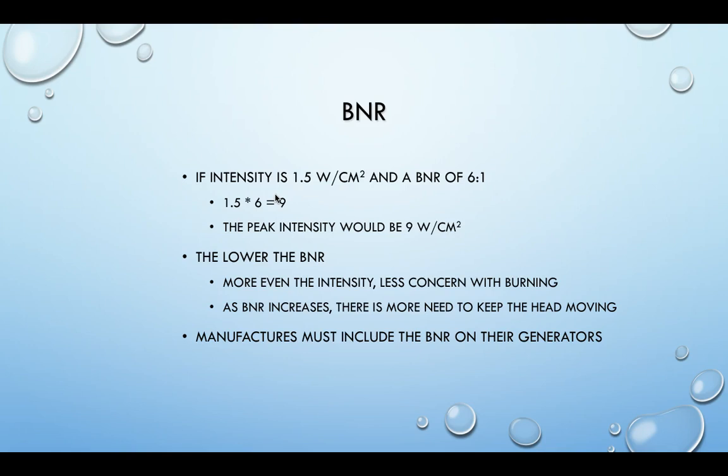And that can actually be dangerous, okay? That can create burns. It can create what we call hot spots, which are areas of this increased intensity that feel very hot and burning to the patient. So this is one of the reasons, we'll have about 3 reasons, that we keep the ultrasound head moving all the time, okay? And one of those is because we have these BNRs that aren't perfect, and we need to keep moving that average spatial intensity around so that those peaks keep moving around.